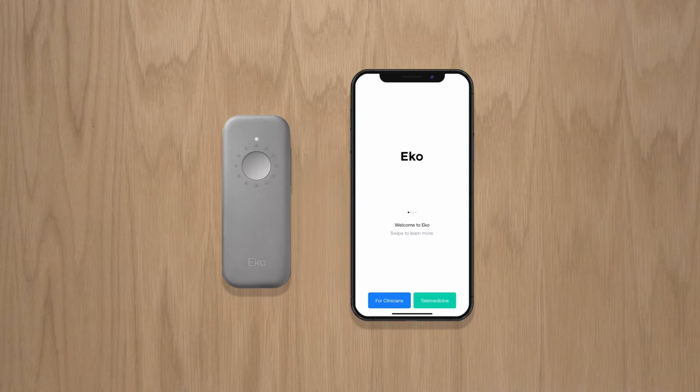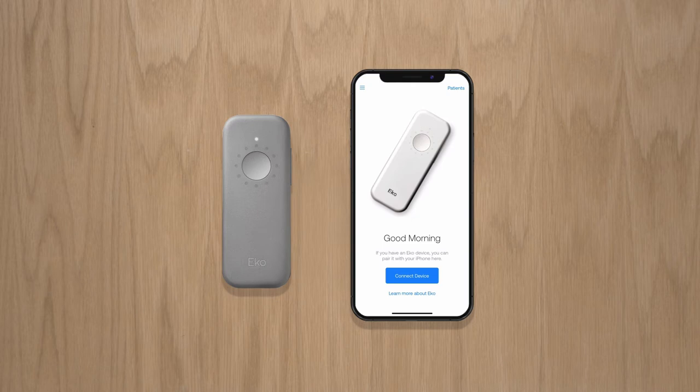Now let's download the Eko app from the Apple and Google Play app stores. Launch the app and you'll be prompted to create your free secure Eko user account. Once logged in, turn on your Duo. Click Connect Device and select Duo.